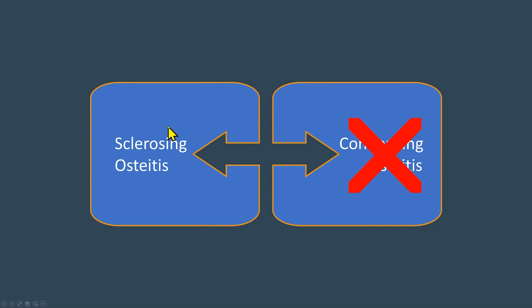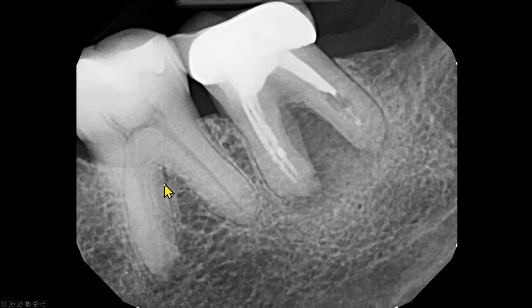Sclerosing osteitis is a better term — do not use the term condensing osteitis. The bone does not get condensed or compressed. Similarly, there is scleroderma but nothing called condensoderma. There is atherosclerosis, not atherocondensosis. Sclerosis means the tissue becomes harder or is replaced by denser tissues. Coming back to the periapical radiograph: this part is the rarefying osteitis, this part is the sclerosing osteitis — two sides of the same coin.